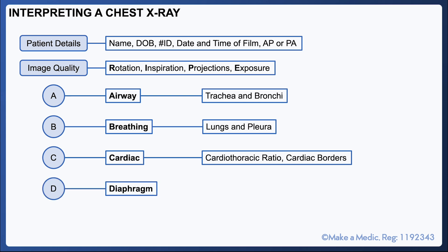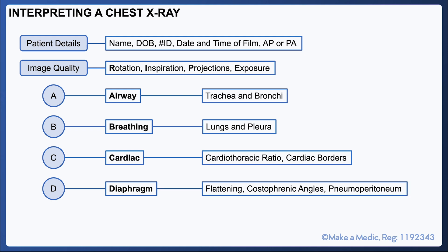The D stands for diaphragm. You want to have a look at the shape of it. It may be flattened in patients with COPD who have hyperinflated lungs, or you may notice that one hemidiaphragm looks raised compared to the other. You should have a look at the costophrenic angles to see whether they can be delineated. Pleural effusions can cause blunting of the costophrenic angles. It's important to look under the diaphragm for the presence of a rim of air, as an erect chest x-ray may sometimes be performed in patients presenting with an acute abdomen to check for pneumoperitoneum, which would be suggestive of a perforation.